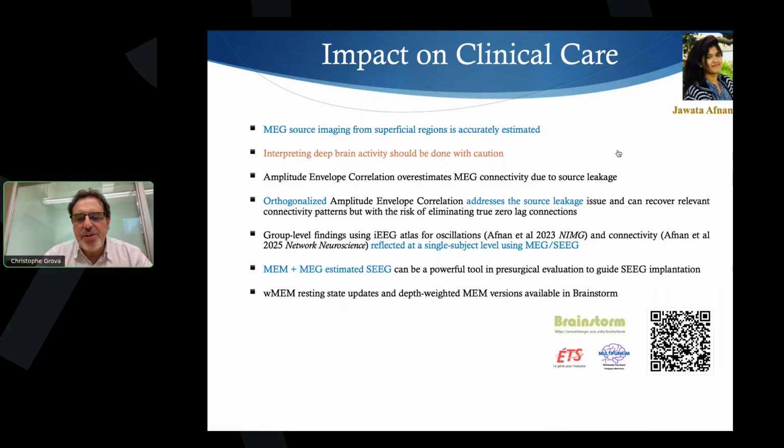It's a bit more tricky, which is another question, when we go to deeper regions, because then the model of fixed orientation is not so true when we want to perhaps target challenging regions like the thalamus, which is what we're going to try in the future. But I'm not sure I answered the question, but if it's volume versus surface-based mapping, that's the way I see the problem.